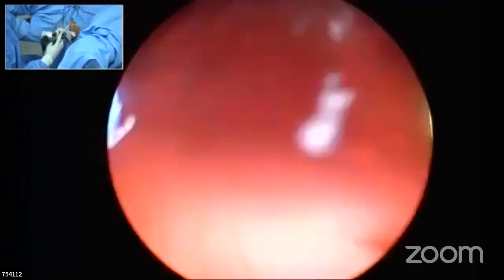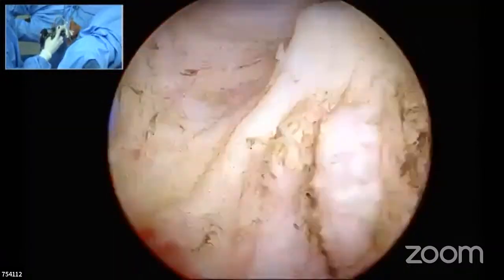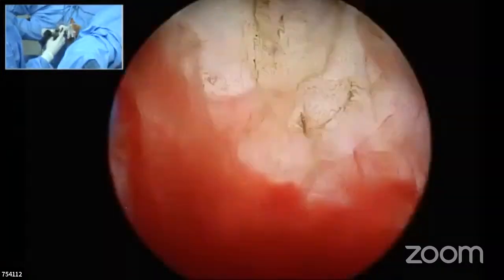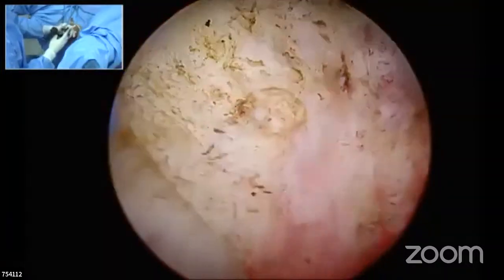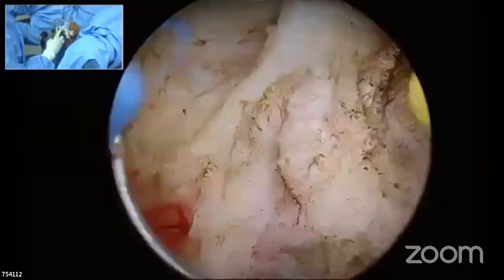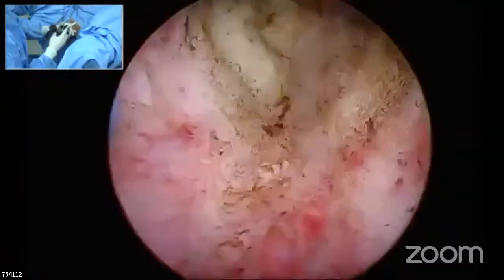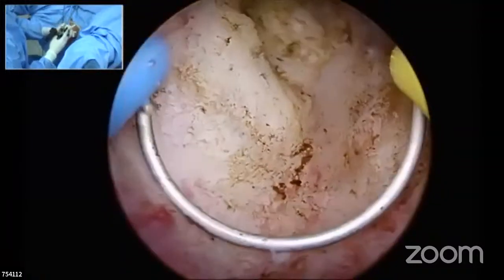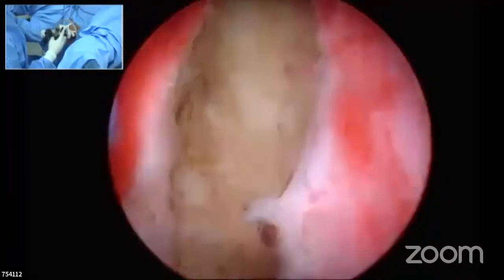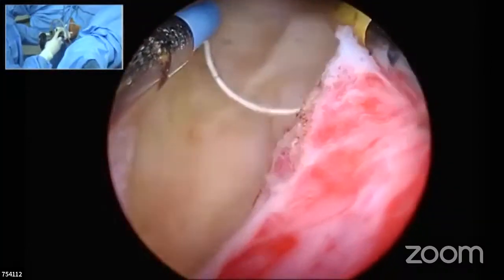I'll do a Barnes technique of resection on one lobe and other sort of resection on the other lobe. Once you reach the bladder neck, this is the bladder neck fibers. Don't be overzealous in resecting the floor of the prostate, because you can do it at the end. Let there be some amount of prostatic tissue stuck to the floor. We don't need to resect it completely at this point of time. So you leave a little amount of tissue and do all that resection as a toileting at the end of the procedure. So that is a better way to do it.